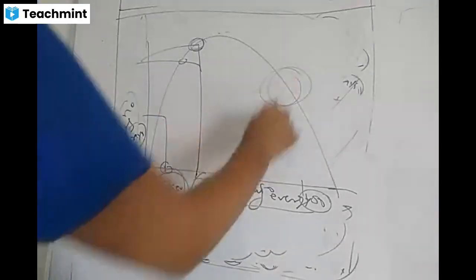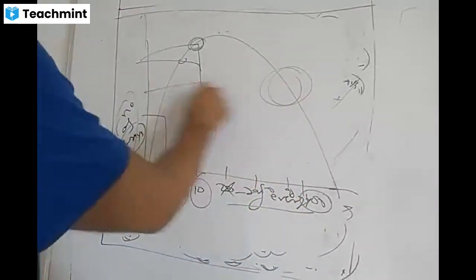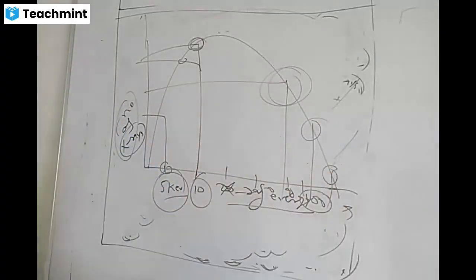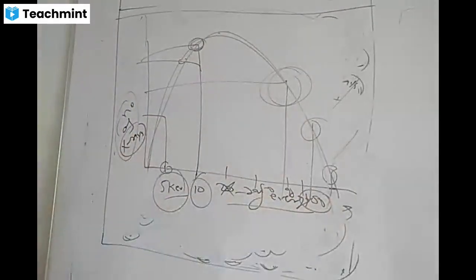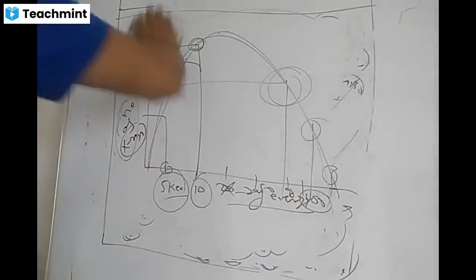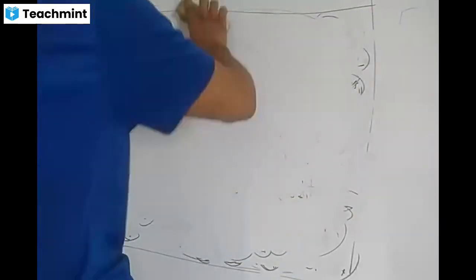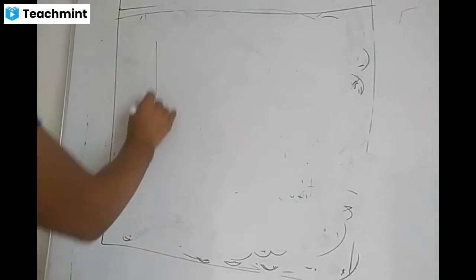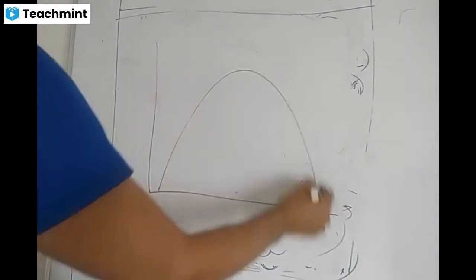Similarly, X-rays with this 90 energy will lie at this point, and some at this point, and 100 are very few in number. So this is a broad spectrum energy graph, which tells you that in case of radiative interactions, X-rays are produced, but they are of various energies. But we have studied one more thing, that was characteristic X-rays.